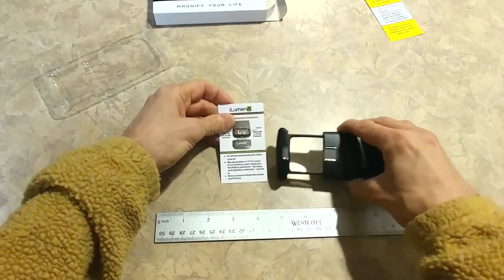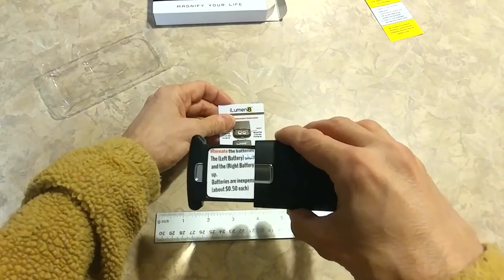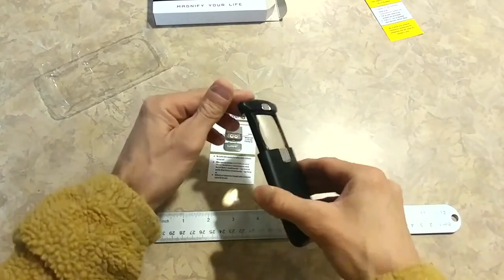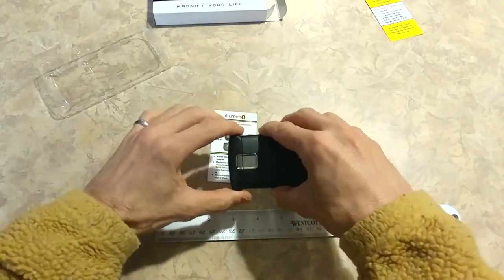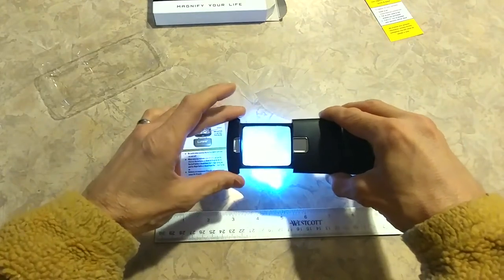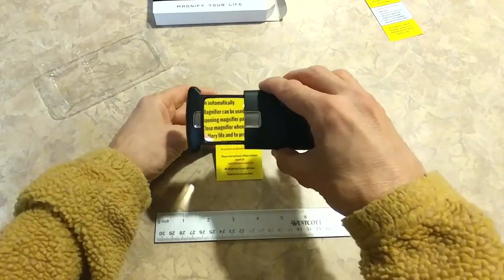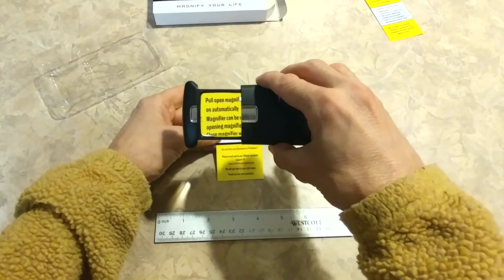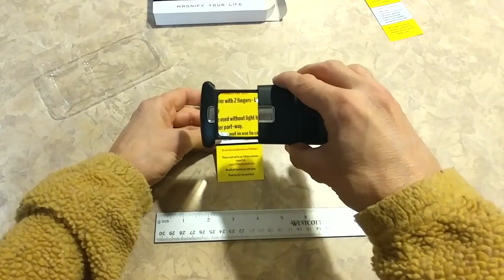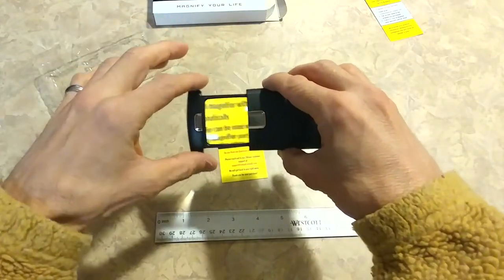For example, some small writing — without the magnifier, versus with it. Look at that — it's just three times the size. What's nice about the square lens is this is an aspheric lens. What that means is the way it's designed, you can read whatever you're trying to read all the way up to the edge. With a round magnifier, more than likely you can't use about half of it, because on the edges they're blurry. Not with this one.